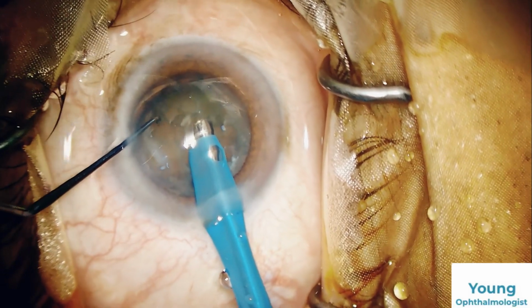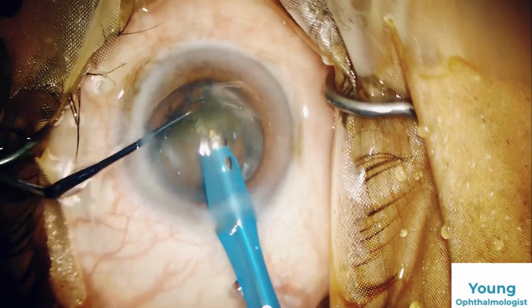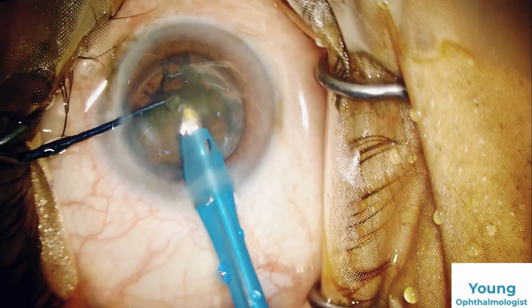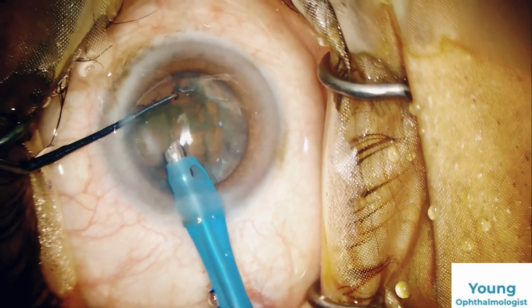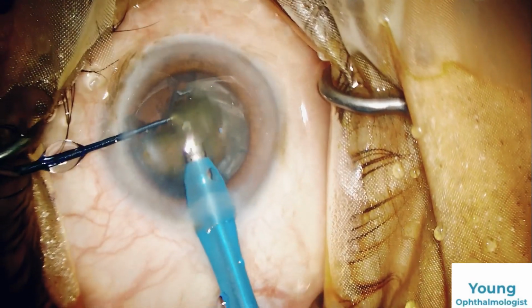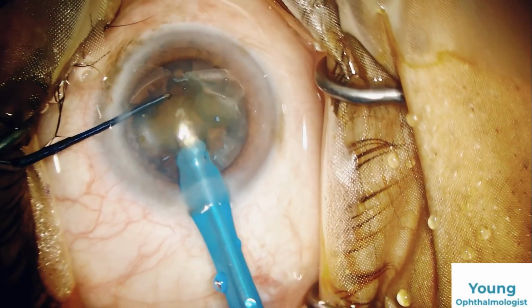Got hold of the D piece. You can see the horizontal chop. Here my settings are vacuum is 400, power is 60 and flow rate is 45.